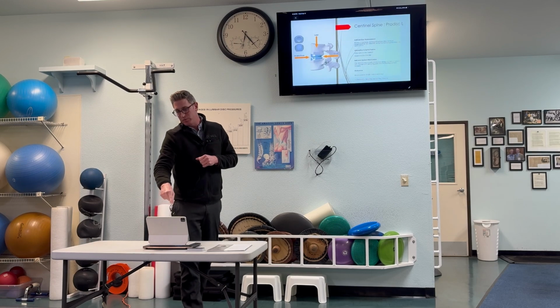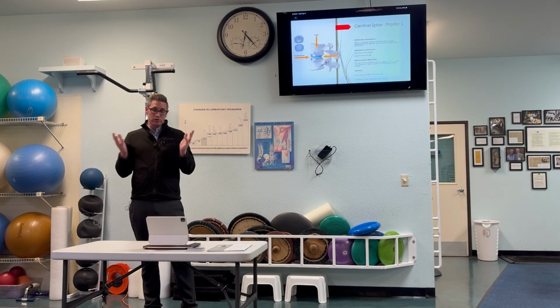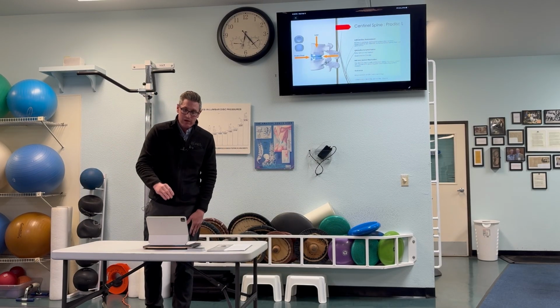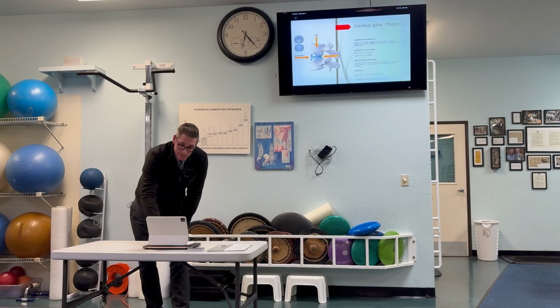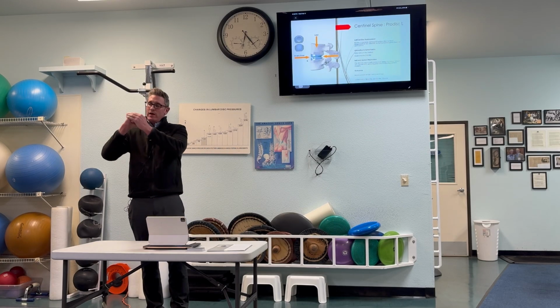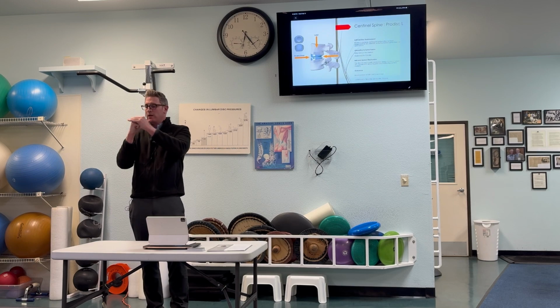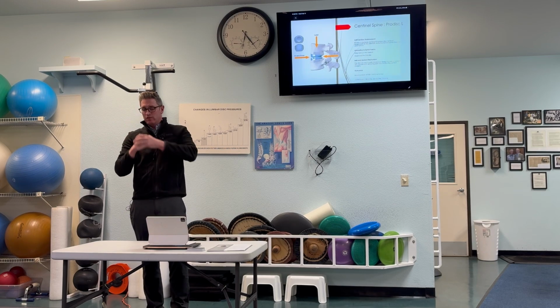This is, again, specifically with regards to the implant that is utilized today. This is the Centinel Spine ProDisc L. The mechanism of how this works is essentially two plates that are placed in the spine, one on the inferior end plate of the superior level, and the other on the superior end plate of the inferior level, and then a plastic insert between them. This is considered a ball and socket design, so it can mobilize on that ball and you still have what we call 6 degrees of freedom. You can flex, extend, side bend, and rotate on your axis as well.